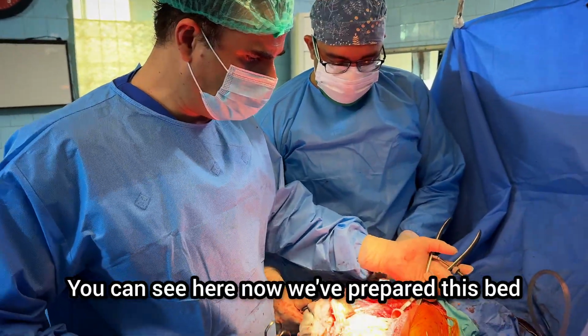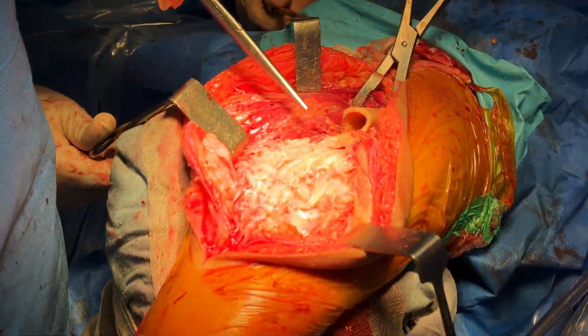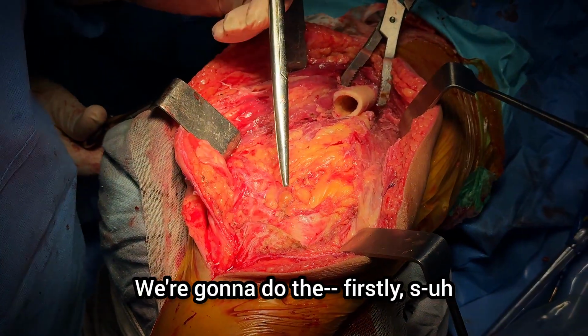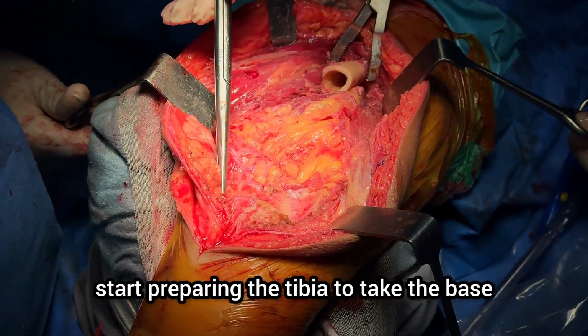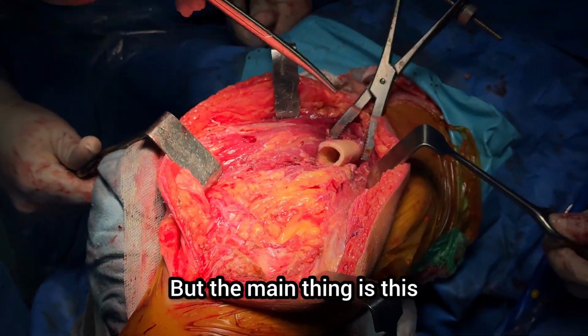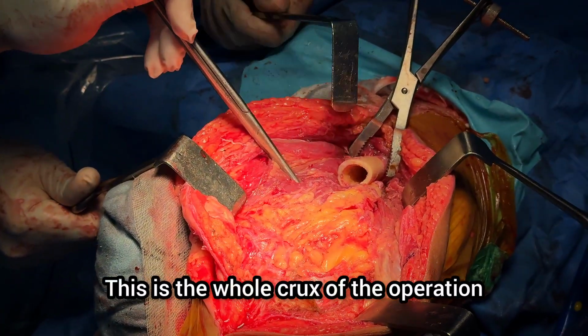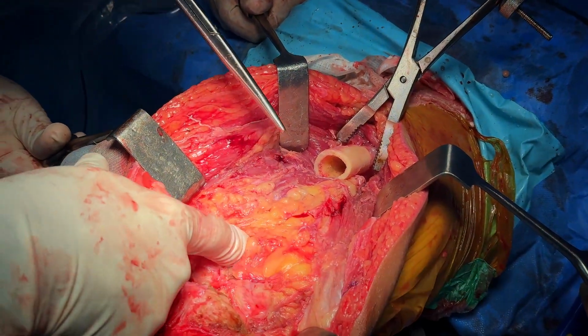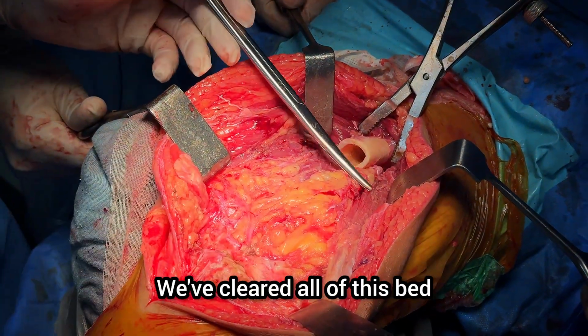You can see here now we've prepared this bed. We've gone through this process. Tibia has been prepared. First we start preparing the tibia to take the base plate with the stem, and I'll go through that with you. But the main thing is this. This is the whole crux of the operation. So you can see the vessel is just underneath here. You can feel the vessel here. So we're clear there. We've cleared all of this bed.